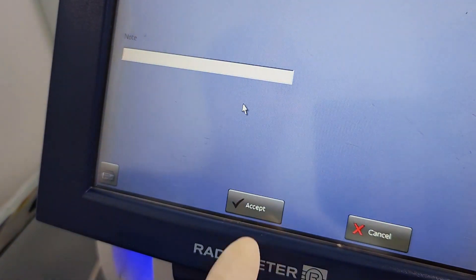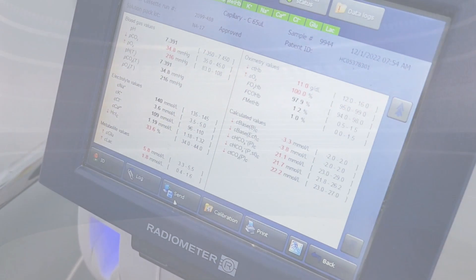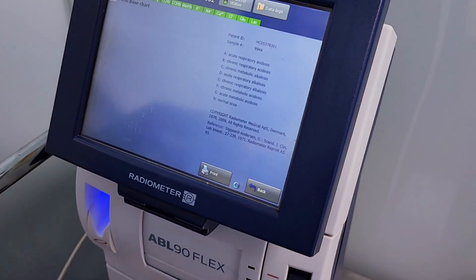Press accept and then send to upload the result to the Cerner. You can also print the acid-base chart for every test.